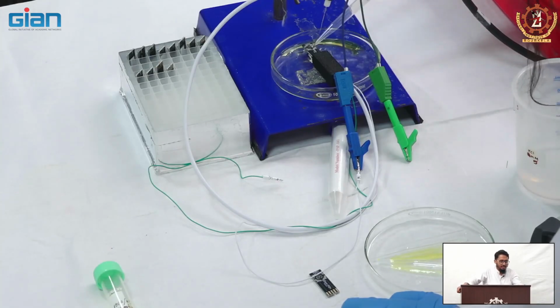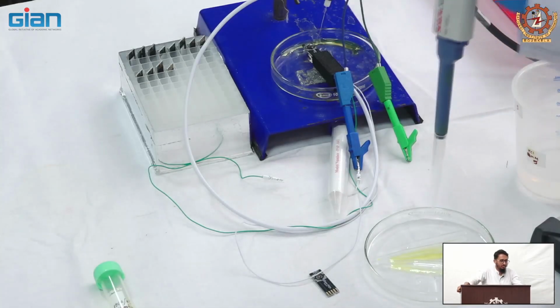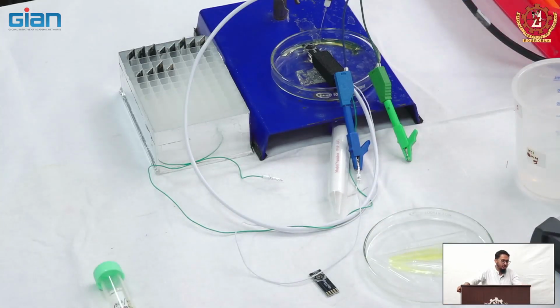So, once we are done with the calibration, you all can also come and do the calibration. If you want to do the functionalization again also using the same electrode or new electrode, you can do. We have up to around 10 to 15 PCB electrodes. So, if you want to do yourself also, it is fine, no problem.